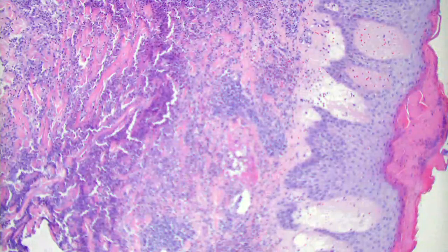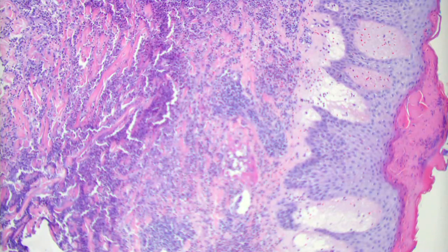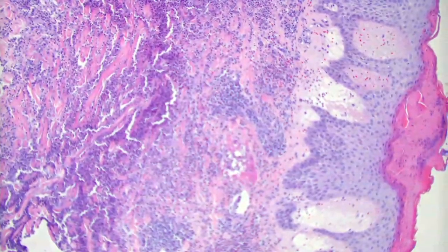And you have to ask about medications. The GM-CSF can do this. What's usually different when you look at GM-CSF related Sweet's and just garden variety Sweet's like this? Those patients are neutropenic often, so they don't have neutrophils to do this, so you may see granulomatous. You get histiocytes quite commonly. It's GM, granulocyte monocyte colonies. The M gets put into this.